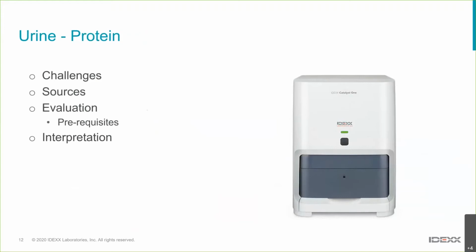Keep in mind that proteinuria, we're interested in renal proteinuria, but proteinuria can also be pre-renal. So if you've got significant hemoglobinuria or myoglobinuria, that's protein. It's going to cause a positive reaction on the dipstick. Those very occasional patients with multiple myeloma, remember that's a plasma cell tumour producing immunoglobulins, so the light chain of the immunoglobulins can get into the urine. You're not necessarily going to detect that with the dipstick, but other tests like the old SSA test, the turbidity test for looking at urine, can detect those. But that's a pre-renal cause of protein.